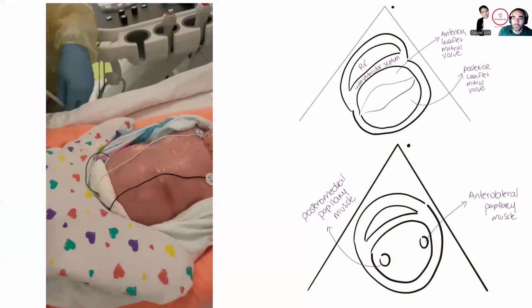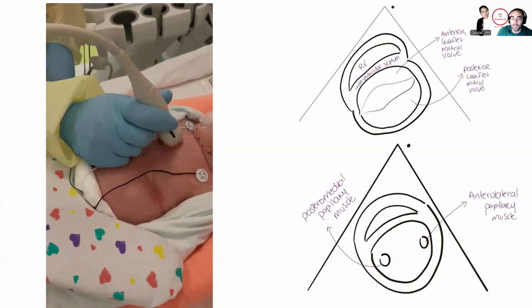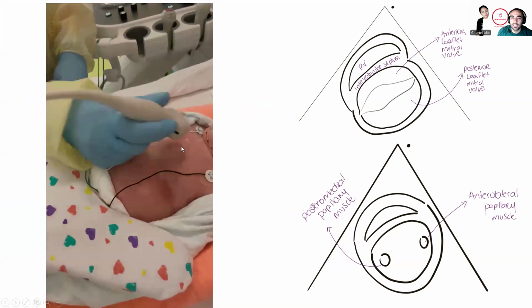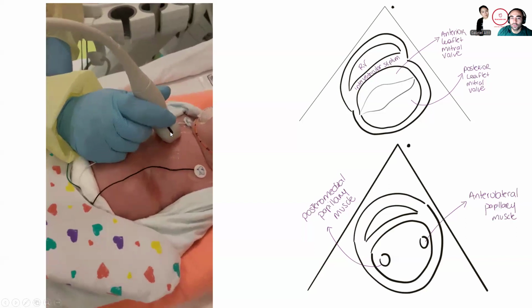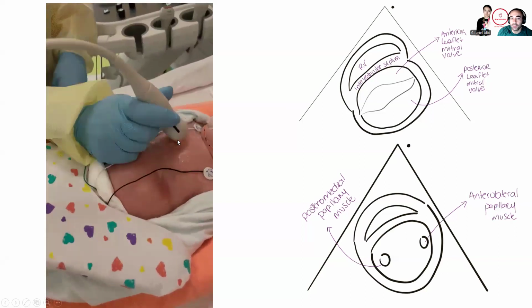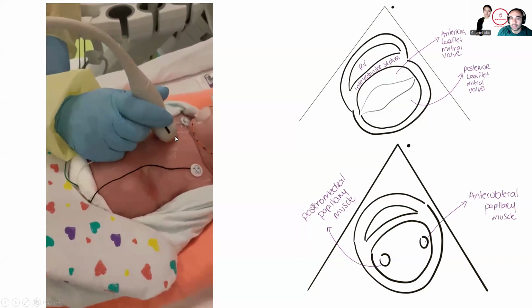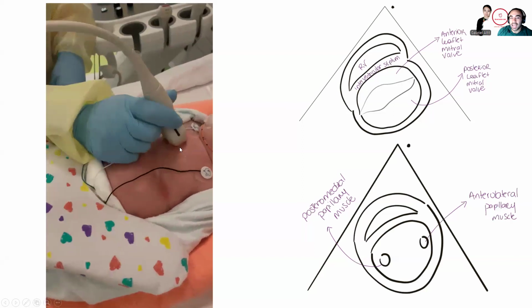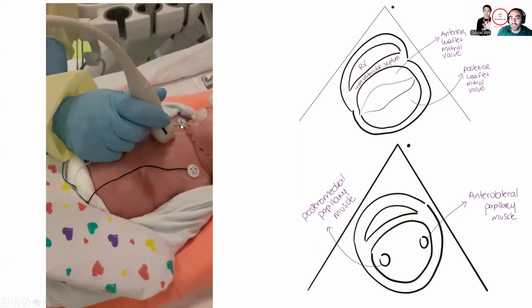So now we'll go to parasternal short axis. We've accumulated a lot of concepts already since the beginning of this recording. You can see here that for the parasternal short axis, the probe is actually 90 degrees from the perfect long axis. So this time the marker is typically towards the left shoulder. And in many of the tinier babies, it's actually much higher up.